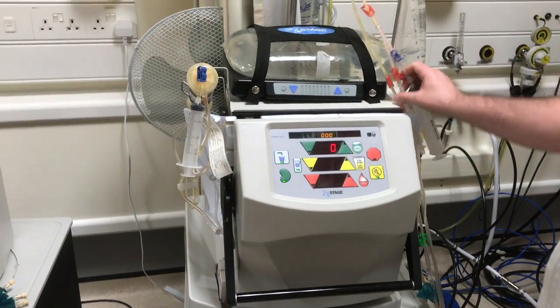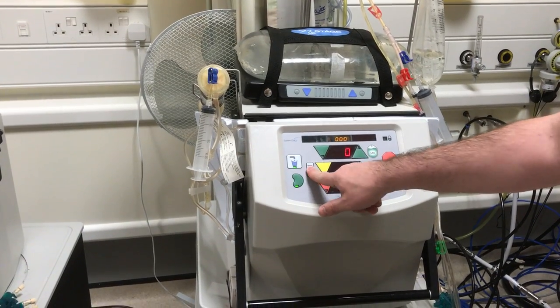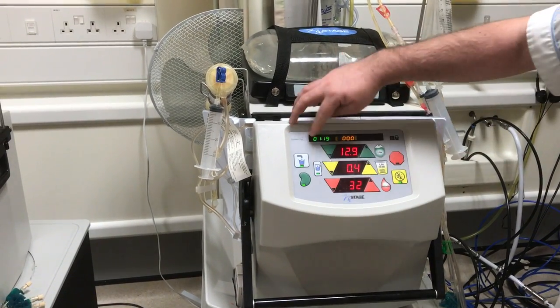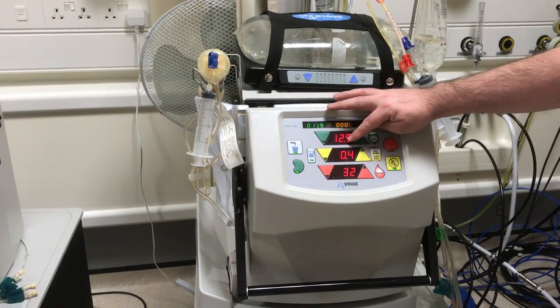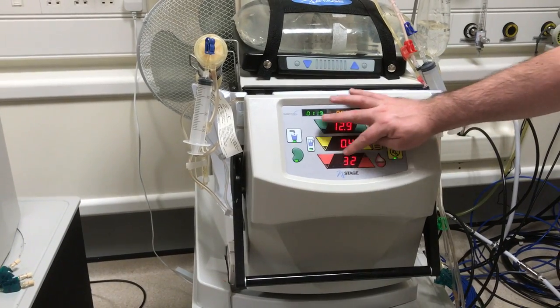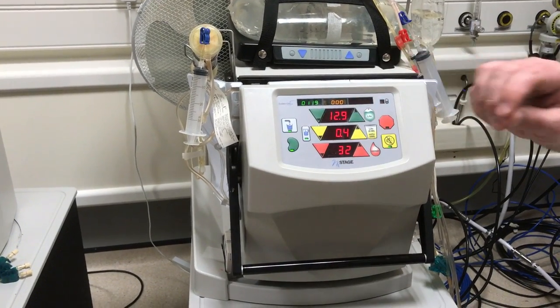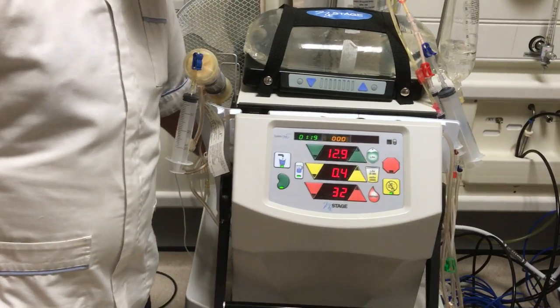At this point, we can take the readings by pressing the jug, and this will tell us how long we've dialysed for, how much dialysate we've processed, how much UF has been completed, and how much blood has been processed. This all goes on the bottom of your dialysis sheet. Once you've taken all this information, you can turn the machine off.